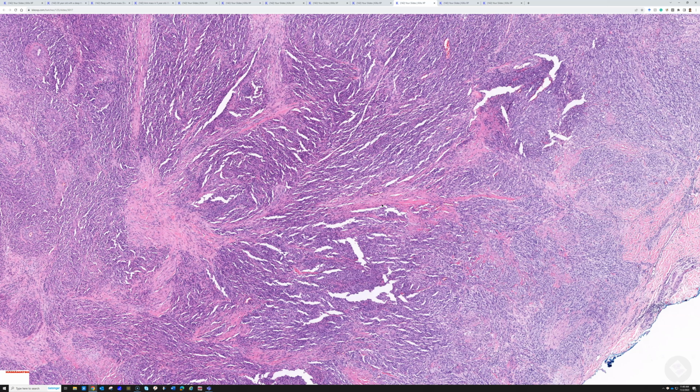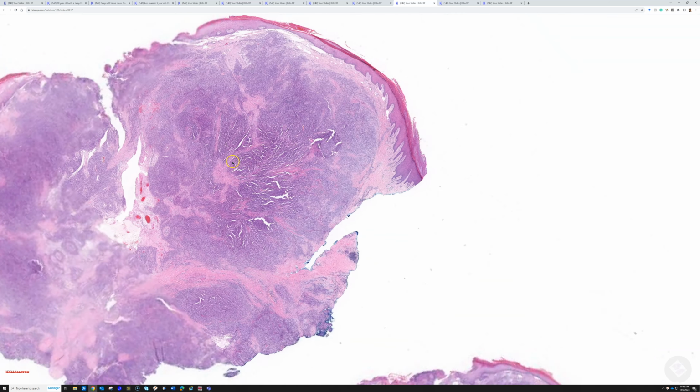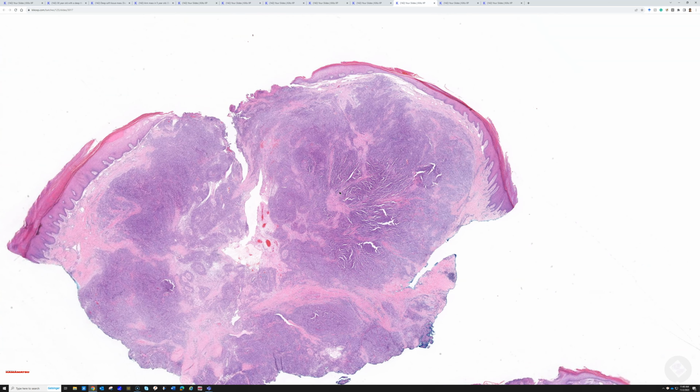The one main caution I want to say is that it's a very sensitive marker for vascular endothelial cells, but it is not specific. It can be positive in a variety of other things, including prostate carcinoma, epithelioid sarcoma, and many others. So just remember that ERG is very sensitive, but not specific. So in a hard case, I'll use all three of the vascular markers, ERG, CD31, and CD34. But here we actually don't need any of them. All we need is an HHV8 immunostain. And no immunostain is perfect in pathology, but HHV8 is about as close to a perfect stain as we can get.